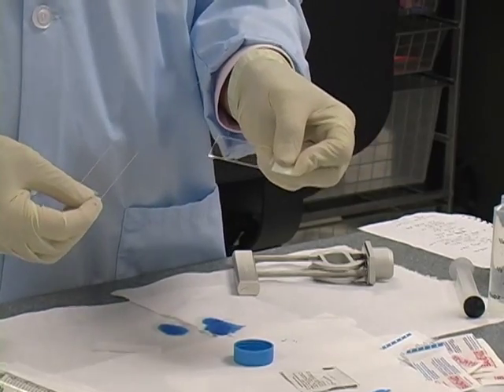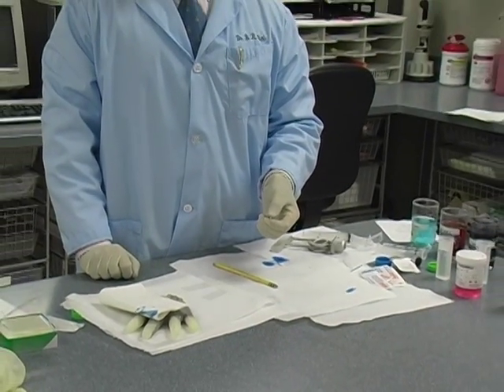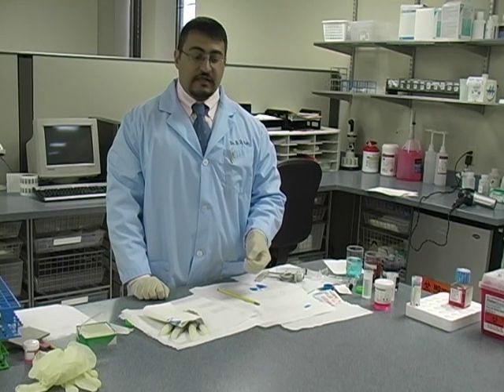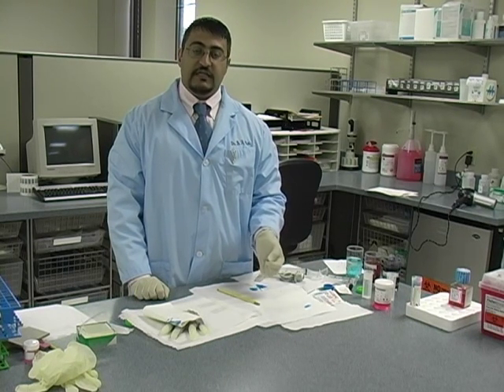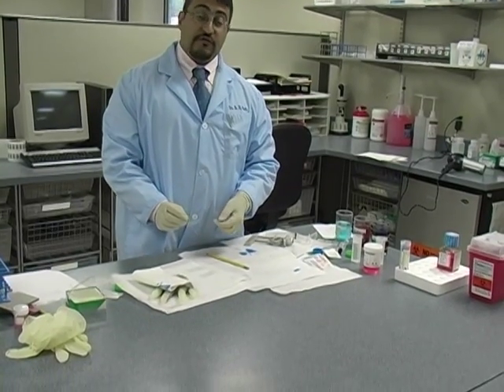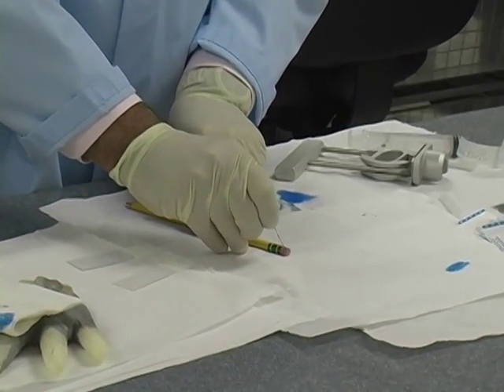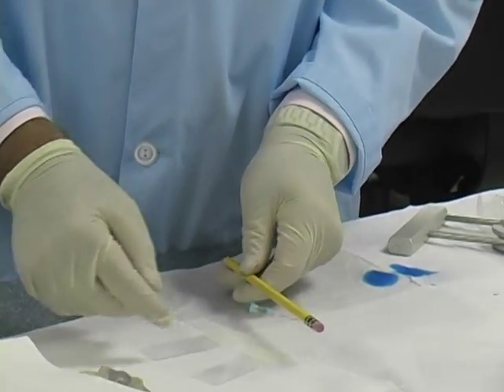We smear our slides and we're ready to go and stain. We alcohol-fix one of the slides. I'll share a trick I learned in training where you can salvage material from the hub of the needle. You need to be really careful because sometimes you're dealing with a needle with no syringe and there's a risk of sticking yourself. What you can do is take the needle and stick it well into a rubber stopper tube — like a blood tube — or a pencil eraser, which gives you a safe grip. Place it down by the slide.